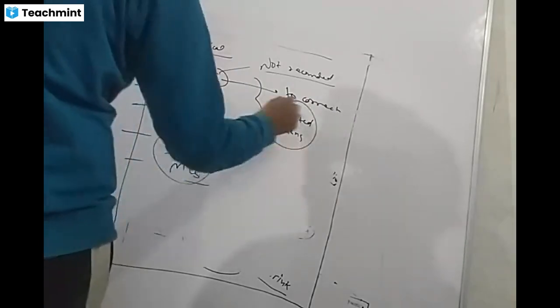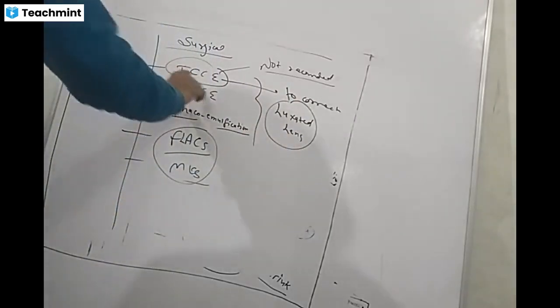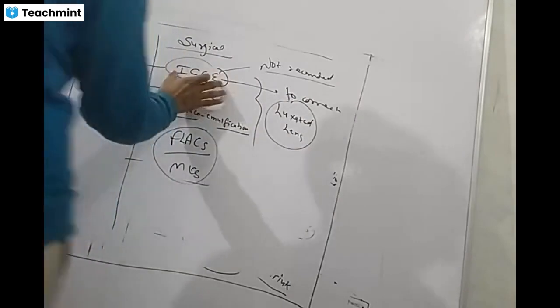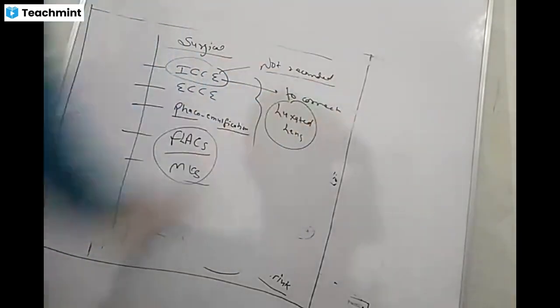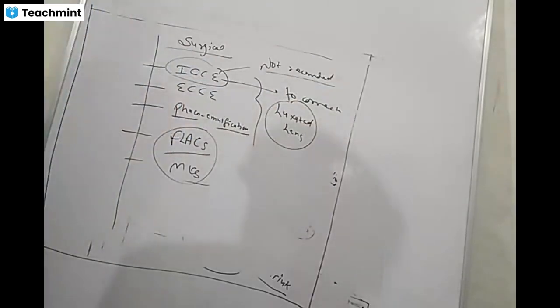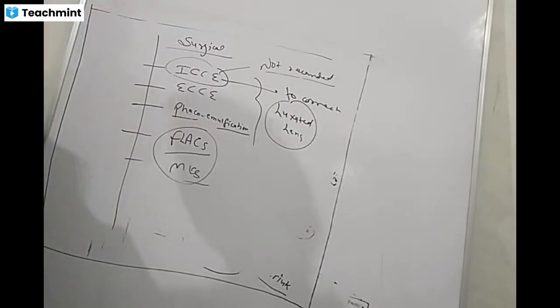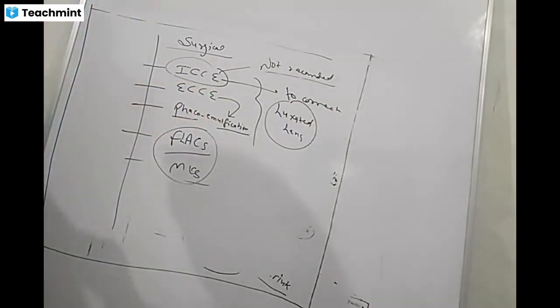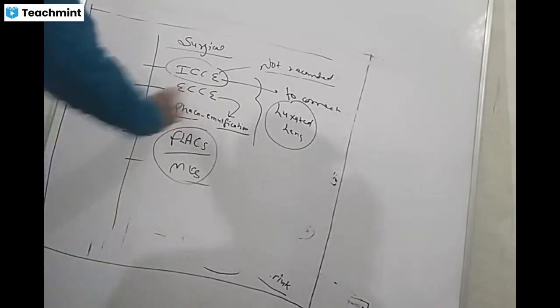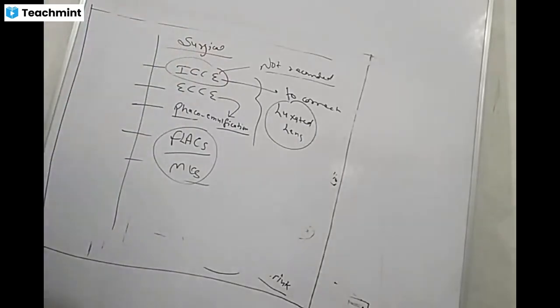If there is luxation of the lens, then to correct that, intracapsular surgery is used, but not for cataract. Extracapsular is used, and phacoemulsification is nothing but a type of extracapsular cataract extraction. So first we'll see the intracapsular.